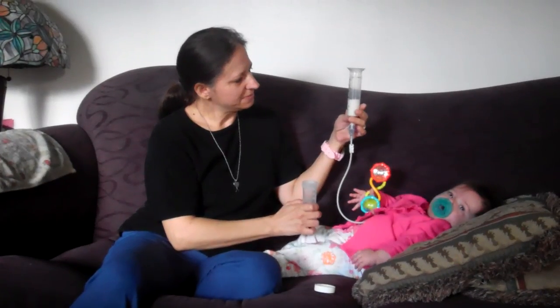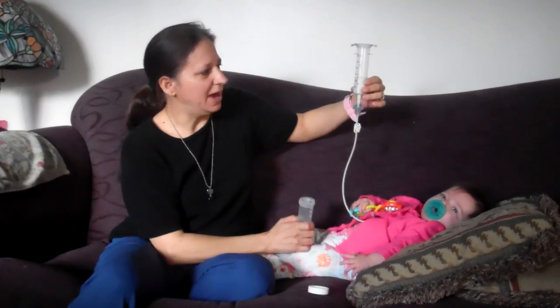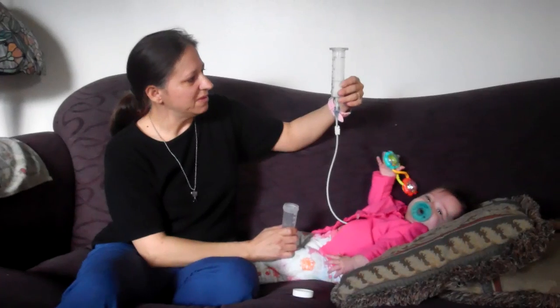Okay. I'm going to lift it up a little bit higher and just try and get the rest of this down in her belly.